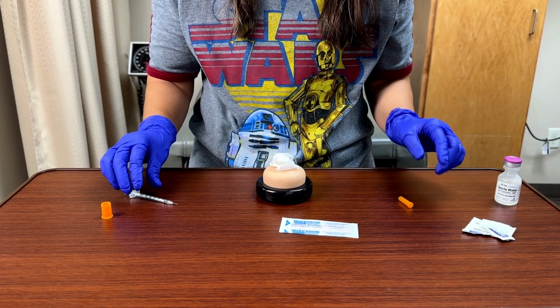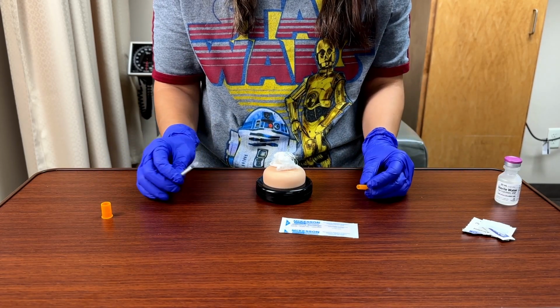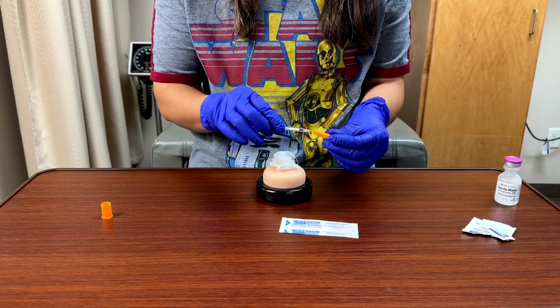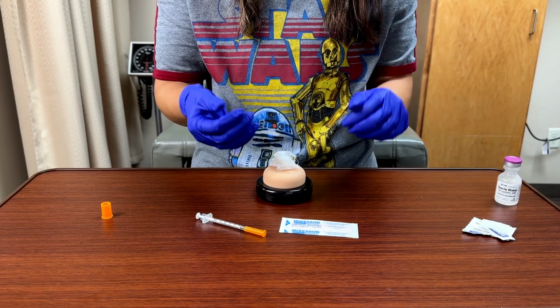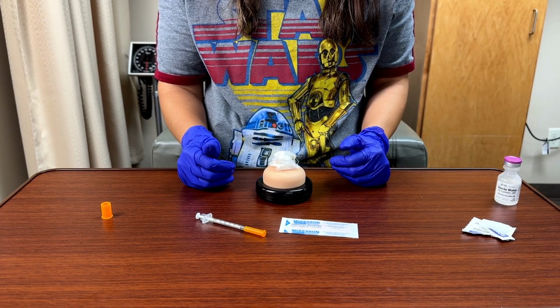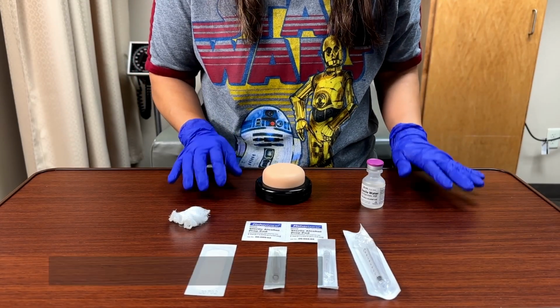Make sure that afterwards, again, that you dispose of your sharps in the correct containers, that you clean the area off if you had any excess blood or anything. You're going to dispose of all your equipment, take your gloves off, wash your hands, and explain the post-procedure instructions to your patient. All right, last but not least, we're going to be doing an intradermal injection.